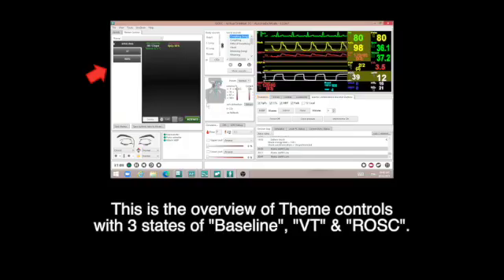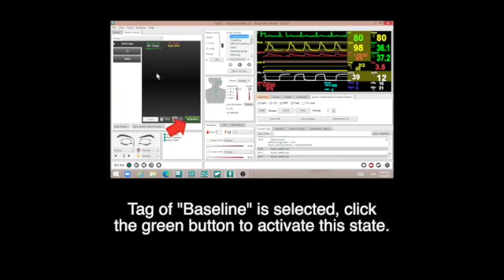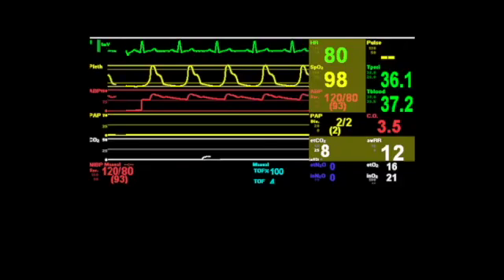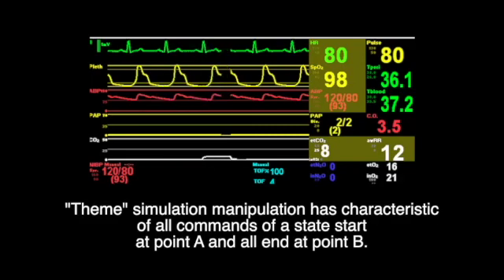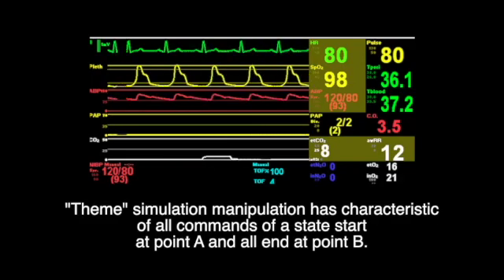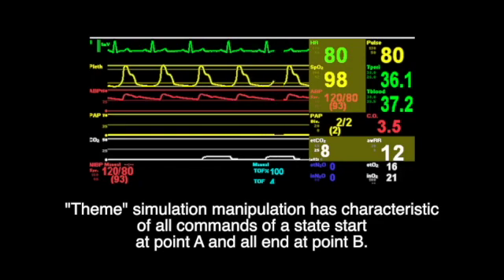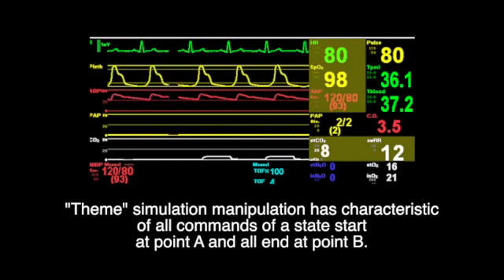This is the overview of themes controls with three states: baseline, VT, and ROSC state. The baseline tag is selected — click the green button to activate this state. Theme simulation manipulation has the characteristic of all commands of a state starting at point A and ending at point B.